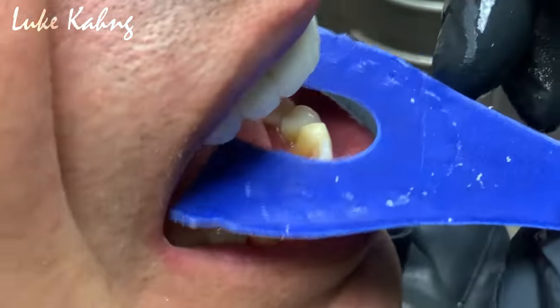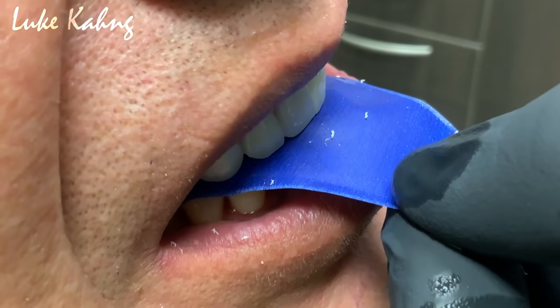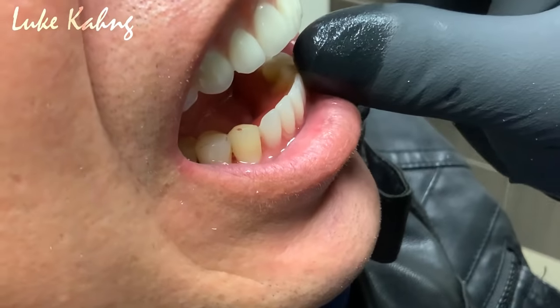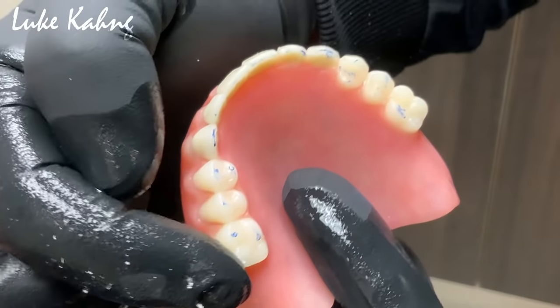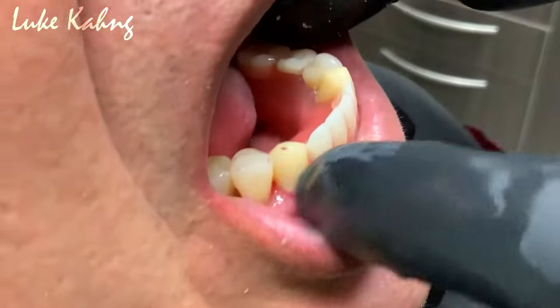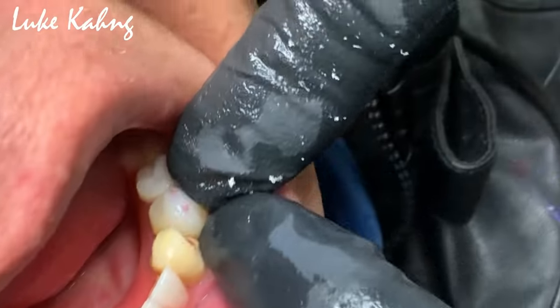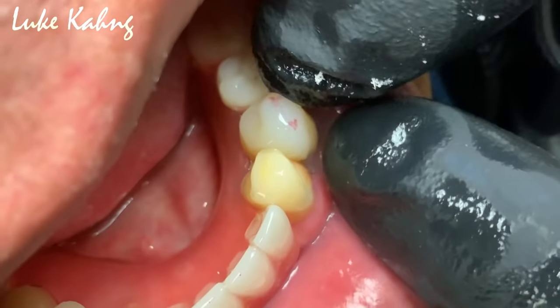So we're gonna just check the bite one more time. Okay, yeah. Close. Tap, tap, tap. Open, okay. So if we take the upper denture off, let's check the points. Nice. Look at that, consistent contacts here. Okay, and then if we look at the bottom one, you can see that he's touching on all of them, and you could actually make a fine adjustment right here, but he's already saying that he's pretty comfortable with it.